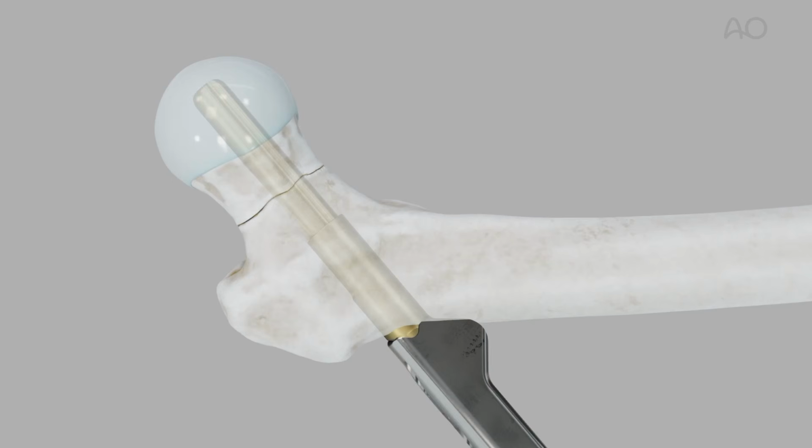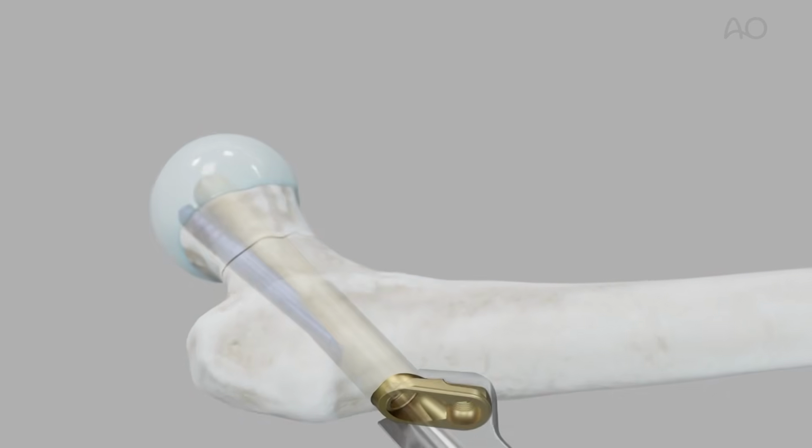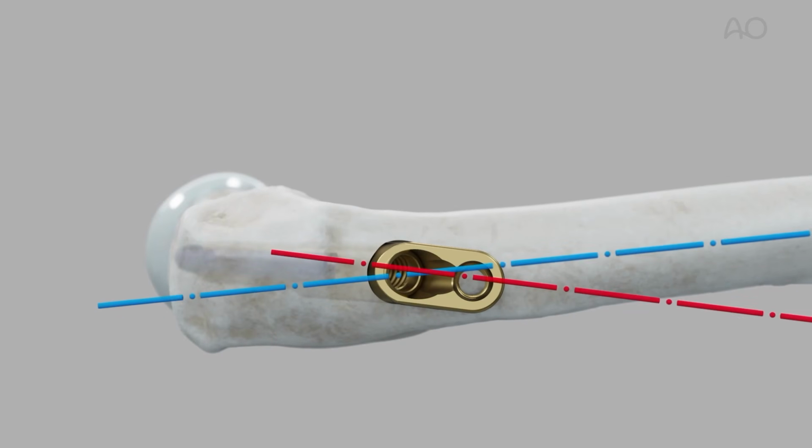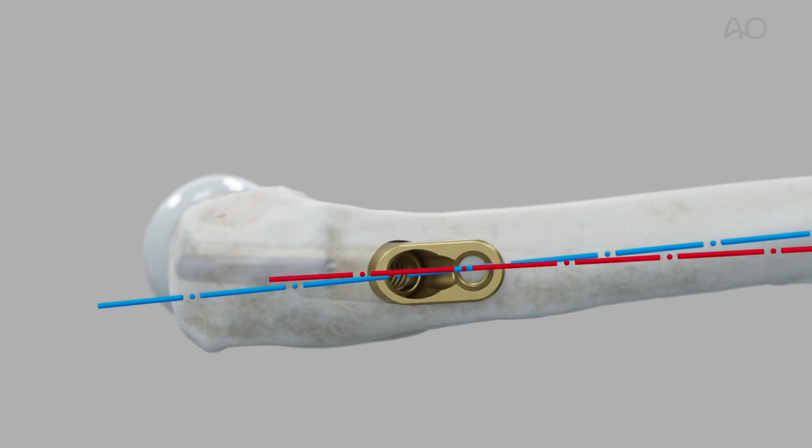It is possible to reverse the screw insertion sequence and insert the anti-rotation screw first. However, this screw insertion sequence, first the anti-rotation screw, followed by the locking screw, does not allow secondary plate alignment adjustments in the situation that the plate is not aligned to the femoral shaft.